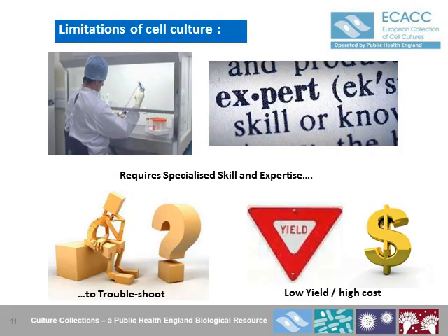But cell culture also has its limitations. It needs a specific expert skill set to cultivate and maintain pure and valid cell cultures. Scientists need to be experts in aseptic technique, and they should understand the biology of the cells and the system they're working with, including the metabolic and environmental needs of the cells used. And unlike microbes, cells are not usually capable of independent growth, and therefore medium compositions are complex.